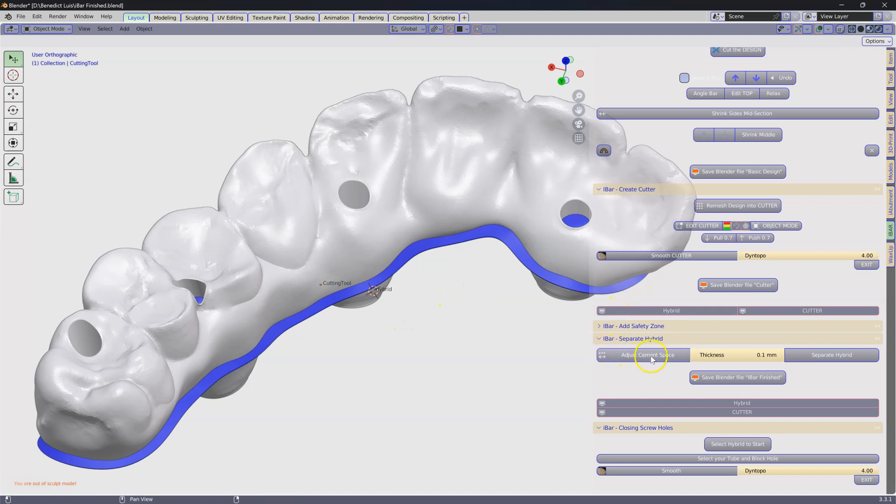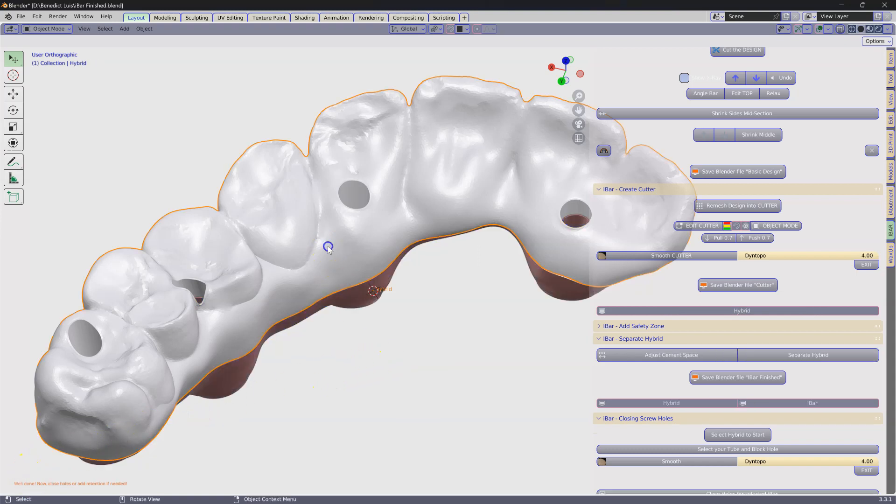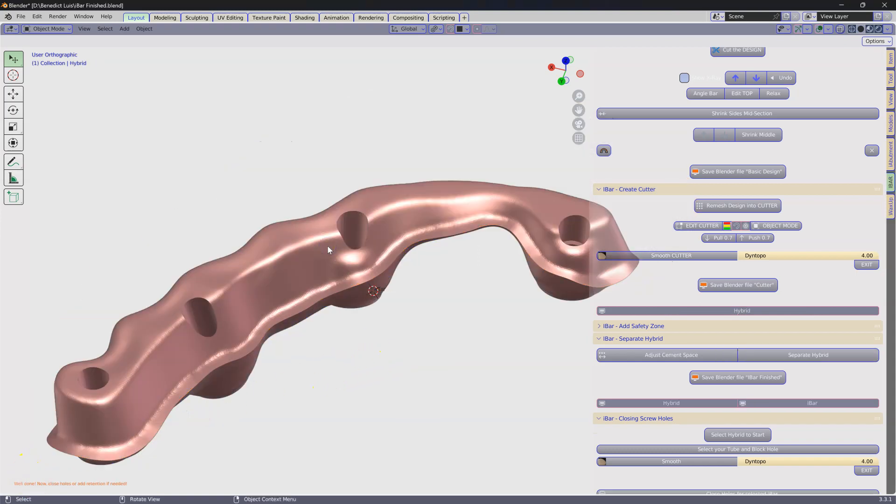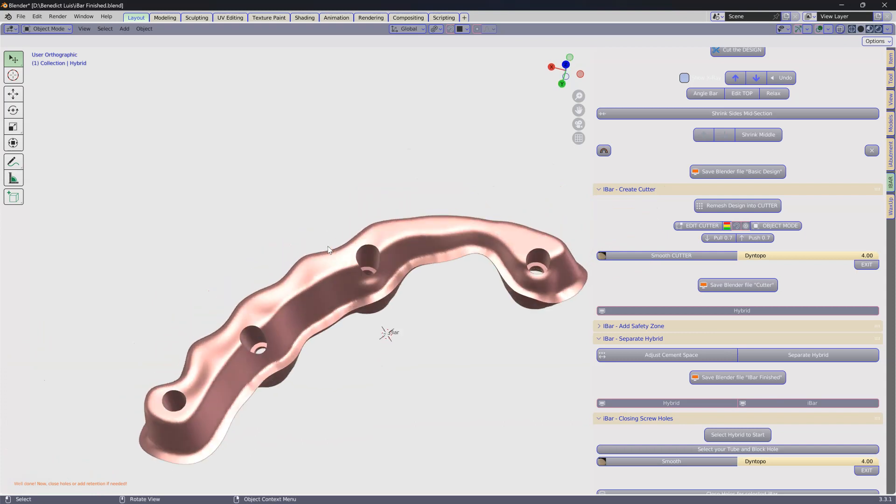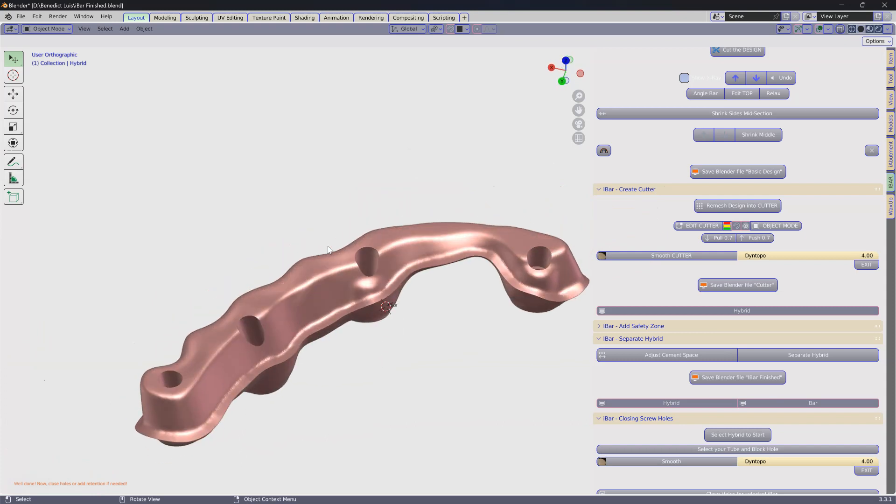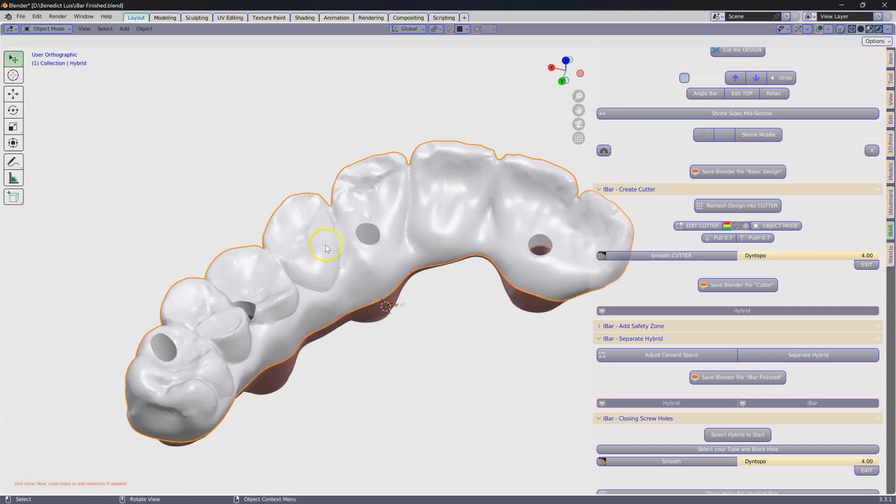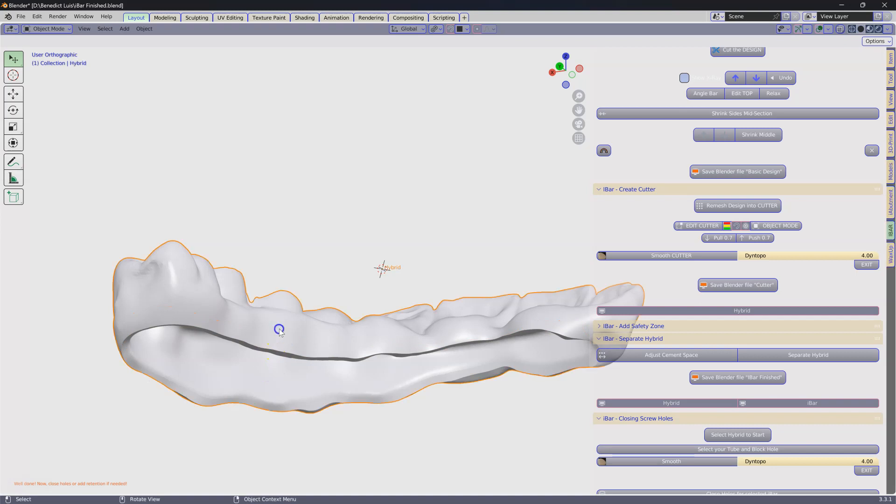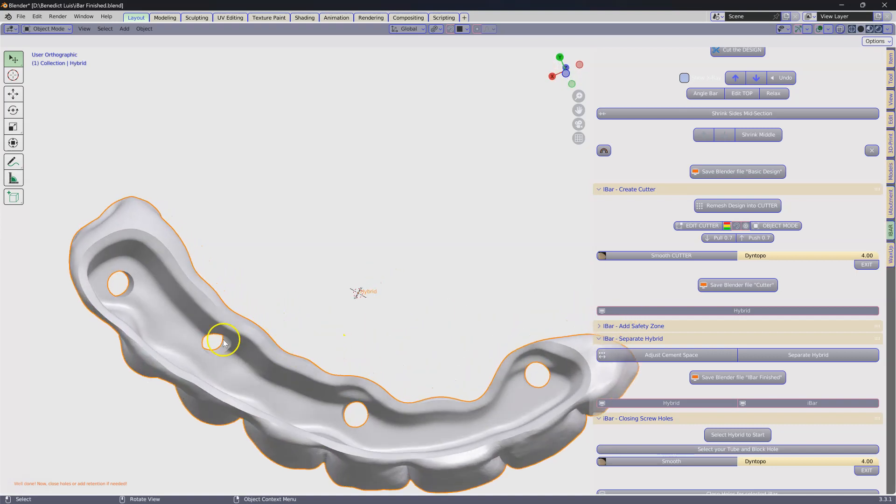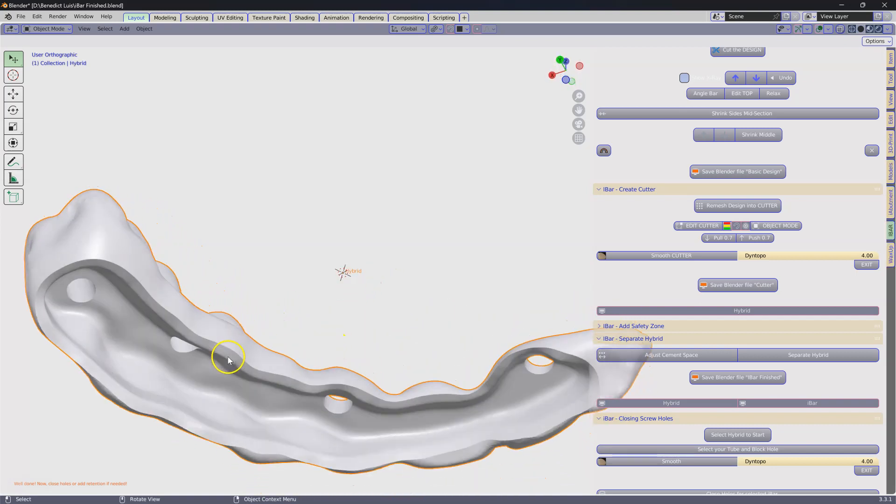The first thing I'm going to do is separate my hybrid. So here we can see the magic doing its work. Perfect. We've got the open hybrid with the screw holes in there.